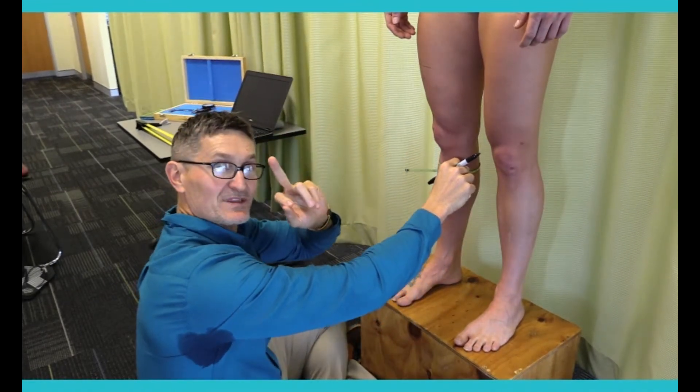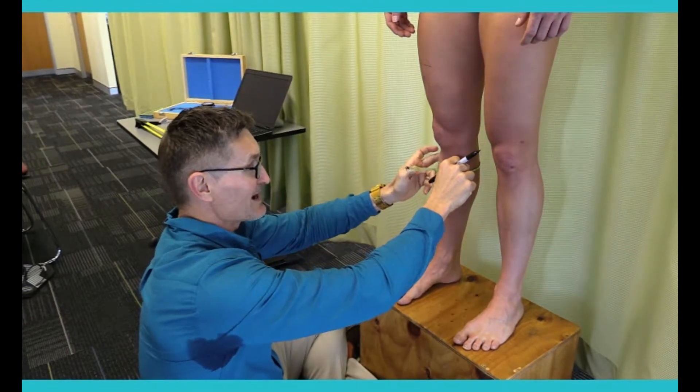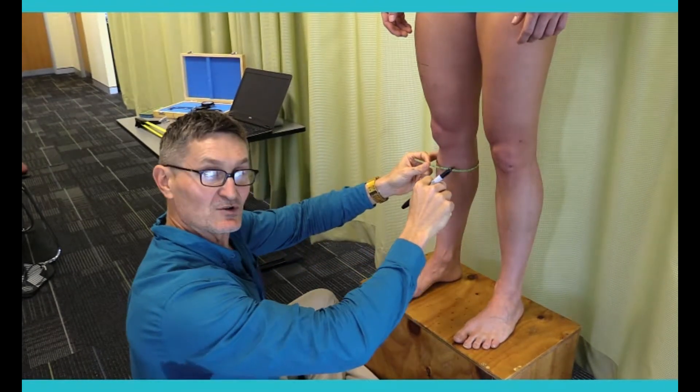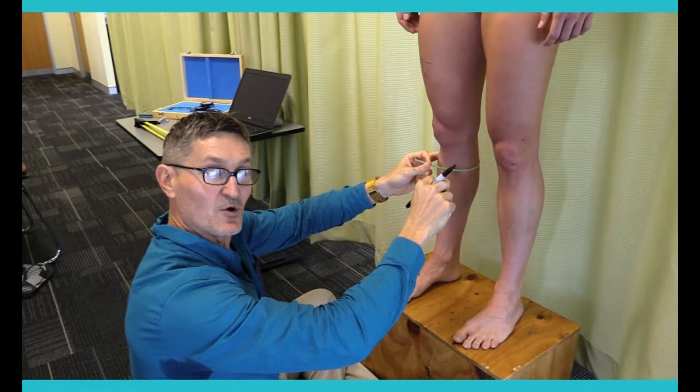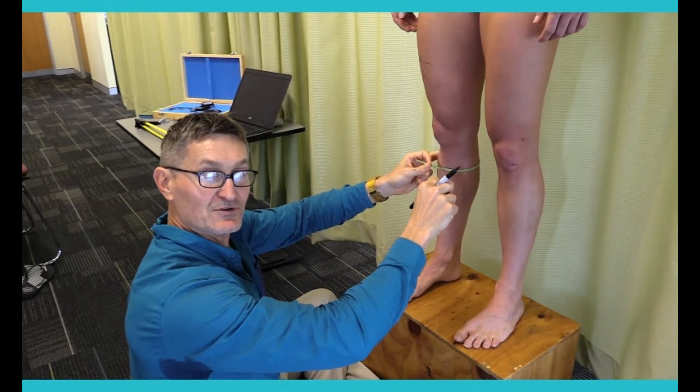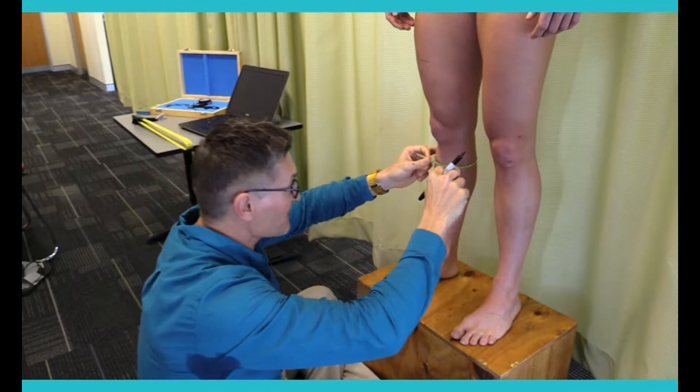Again, technically, really important to get that middle finger free on the back of the left hand. It's going to stay in contact with the tape and the skin surface the whole way through. And that will give us really good control over the tape from the front, as well as the back.